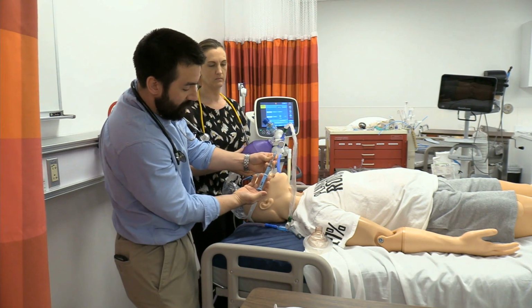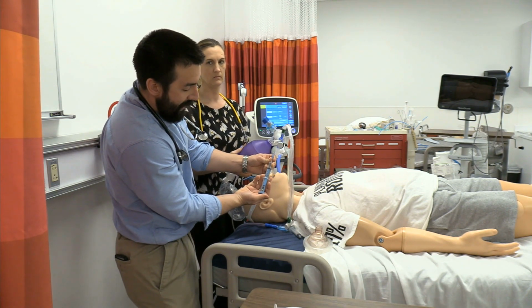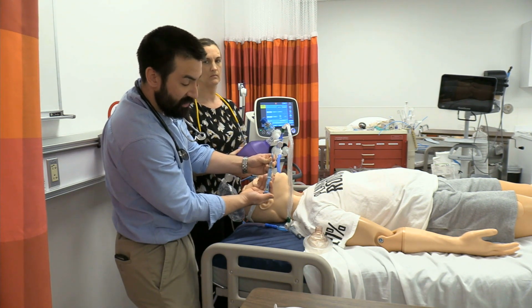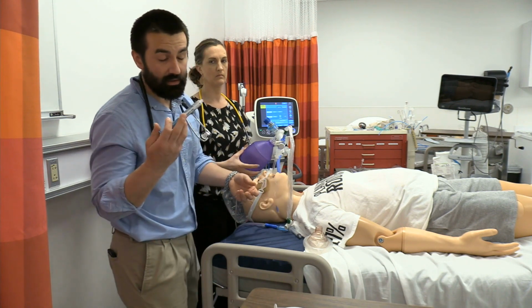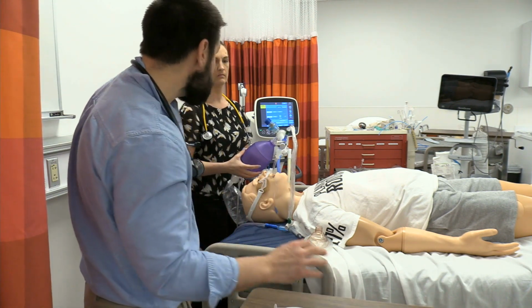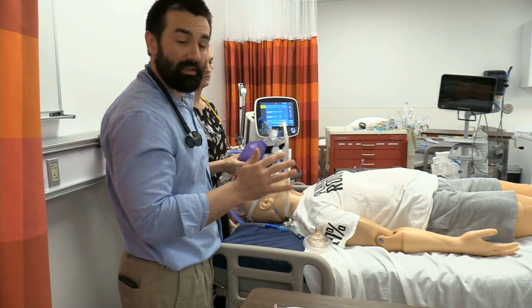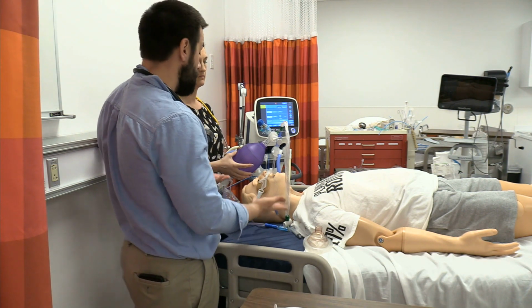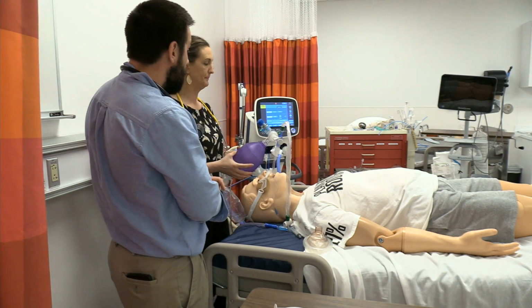I'm going to look at the pressure. All right, my pressure's a little bit low. I'm going to add air to get, right now I'm about 28 centimeters of water pressure, which is perfect. If I was too high, I just draw back until my cuff pressure gets where I want and then quickly take it off because you can lose a little volume of air there. We get this patient sitting back up at about head of the bed 30 degrees, clean up our mess. The 30 degrees part is for ventilator-associated pneumonia protocol. And go from there. Nice job, Doc.